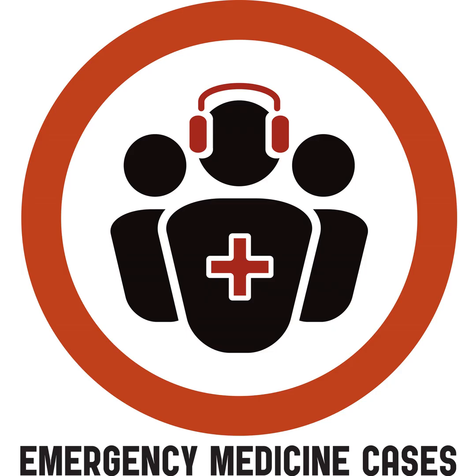So again, little pieces, and what we have is our prepackaged BVM, right? So one of our pre-packs that we're working on is going to be your base equipment that you're going to go in with, right? And you're going to have your VL that's sized appropriately. Your primary device, your Macintosh VL, is what we're going to be using, but we'll have our disposable hyperangulated there. We're going to have the components that we're going to use with that device, the bougies and all the things that are in our pre-packed base equipment.